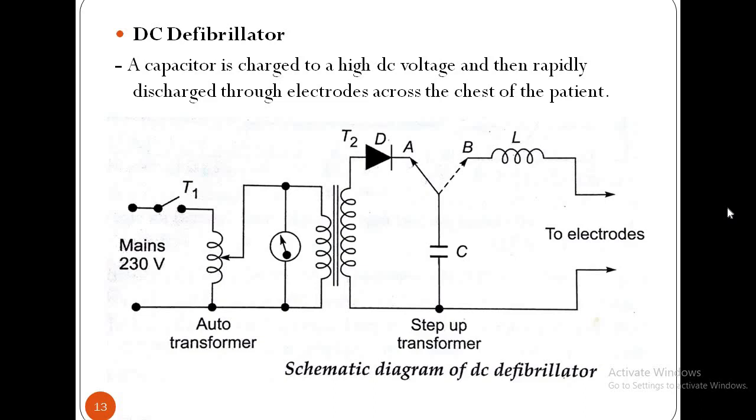In a defibrillator, an enormous voltage of approximately 4000 volts is initially applied to the patient. Although short duration pulses can affect defibrillation, the high current required impairs the contractility of the ventricles. This is overcome by inserting a current limiting inductor in series with the patient circuit. The disadvantage of using an inductor is that any practical inductor will have its own resistance and dissipates part of the energy during the discharge process.